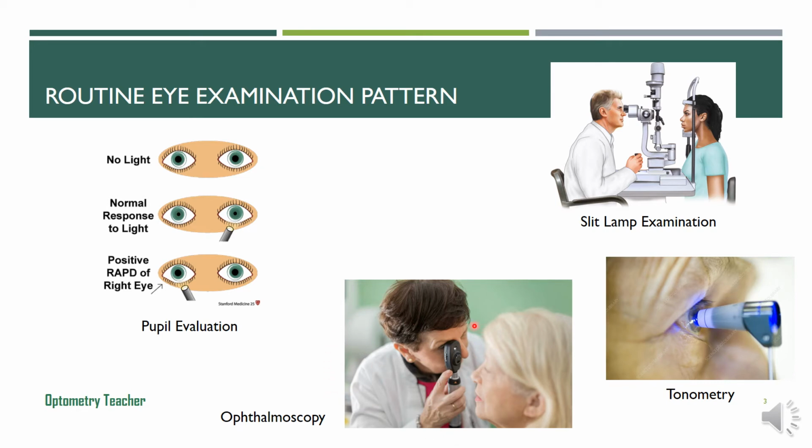Now, ophthalmoscopy, it's a way to check the retina, and it depends upon what ophthalmoscope you are using in your clinic. So someone will be able to use a fundus camera, that means a non-mydriatic fundus camera. You do not really have to do an ophthalmoscopy. The idea is to try to look into the retina. You can use a direct ophthalmoscope, you can use a fundus biomicroscopy with the help of a slit lamp, a 90D lens or a 78D lens, or if we are confident in doing indirect ophthalmoscopy, yes, by all means.